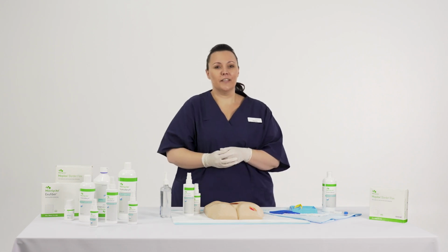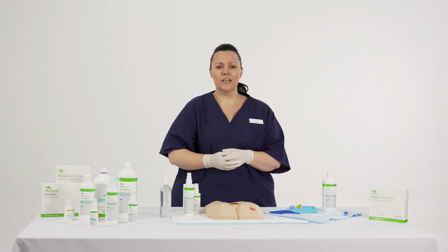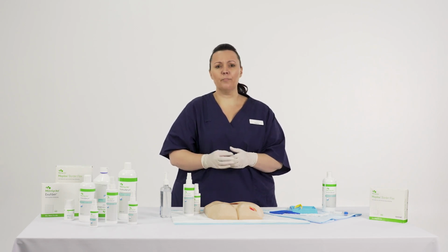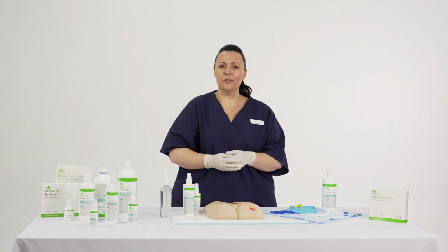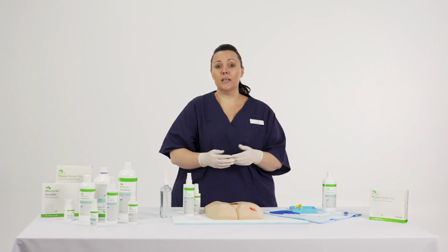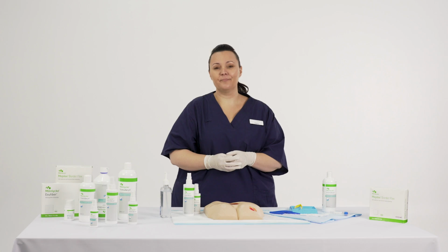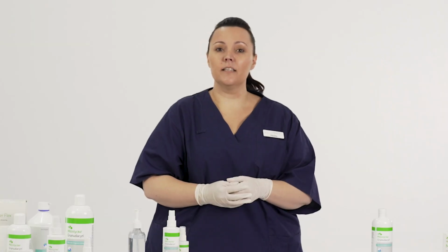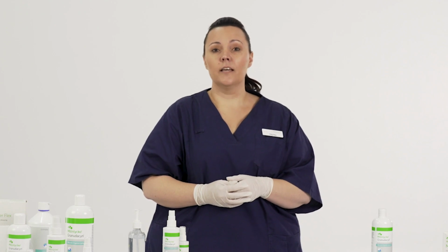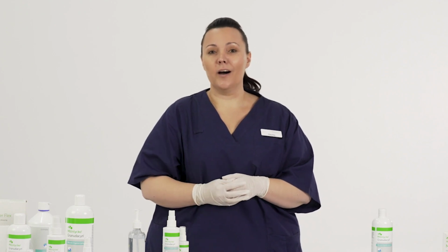The gelatinous slough in this wound requires some increased force. My goal is to pick up and mechanically remove the gelatinous slough. For necrotic tissue, it is so important to determine what type of debridement is needed. Can I achieve this using mechanical debridement, or do I need to consider sharp debridement with someone experienced in debriding? If debridement is being considered at the bedside, we really do need to think about our local policies and procedures and what other considerations are required.